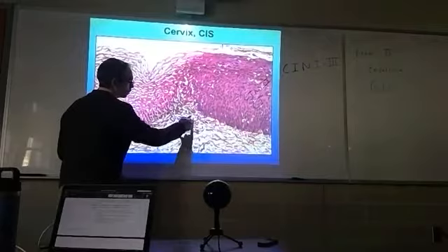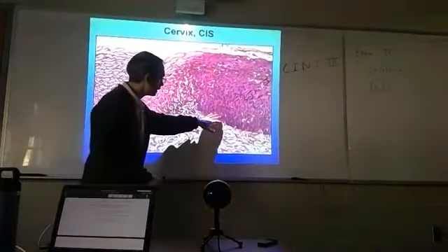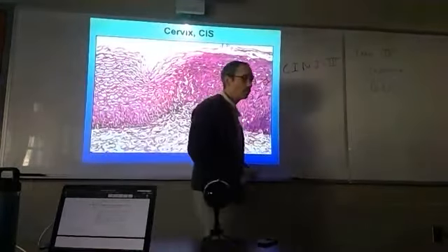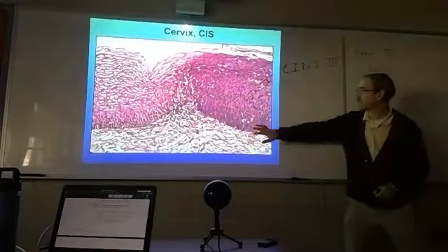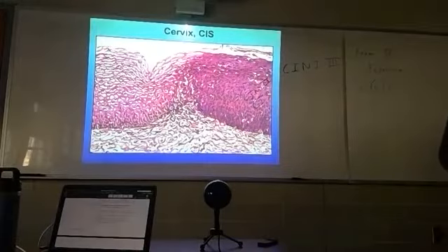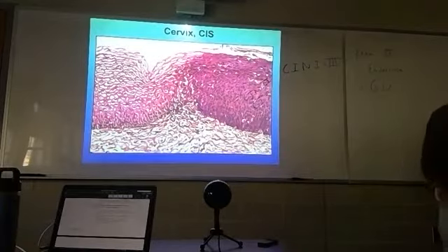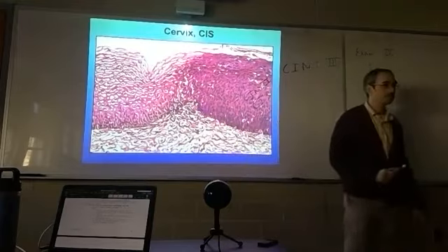You can see an array of inflammatory cells here. They're recognizing this dysplastic epithelium and they're trying to attack. Best possible outcome, it will be successful in destroying all of these dysplastic cells. The cells are wiped out and replaced with a normal epithelium. Very often, a dysplastic cervical epithelium will spontaneously resolve. And that's because the woman's own immune system is taking care of this.